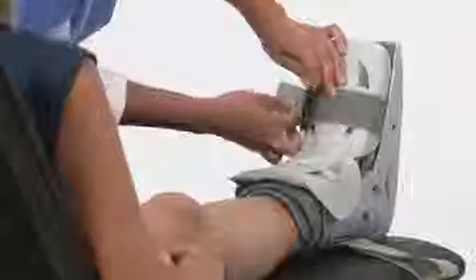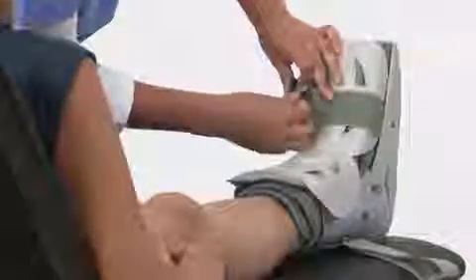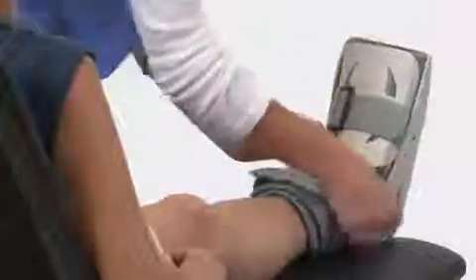Finally, secure the straps from bottom to top. Tighten them so they are snug and comfortable.